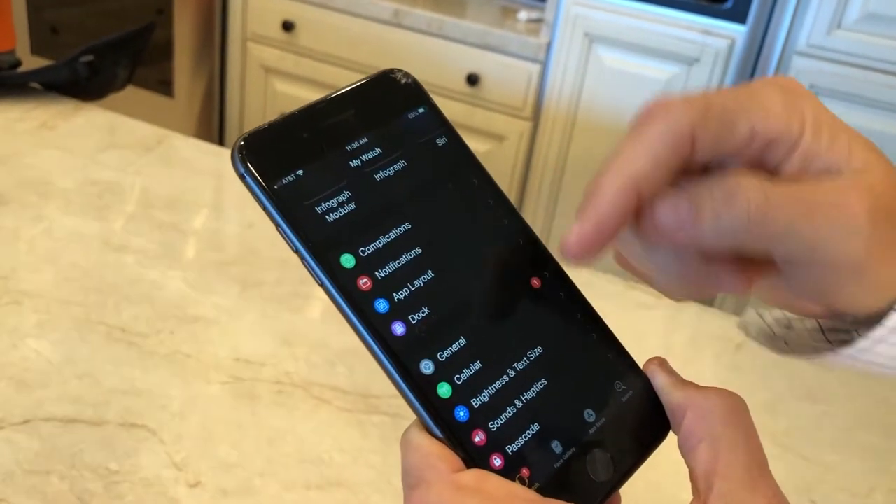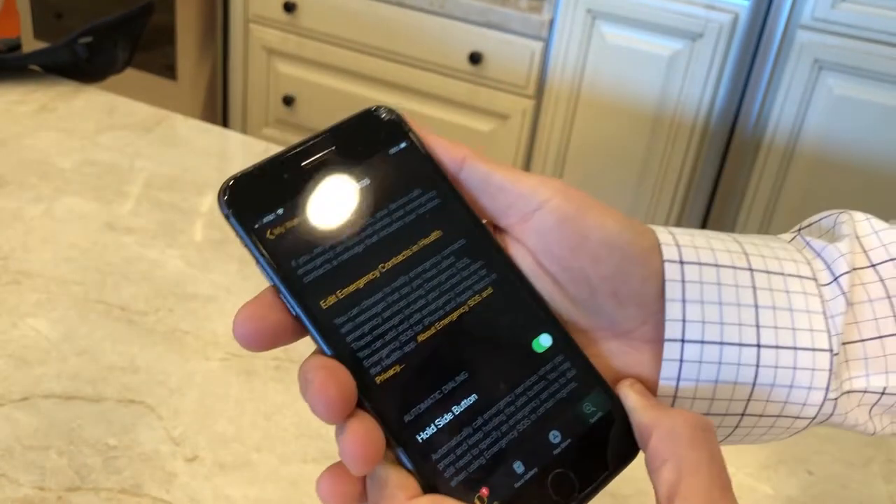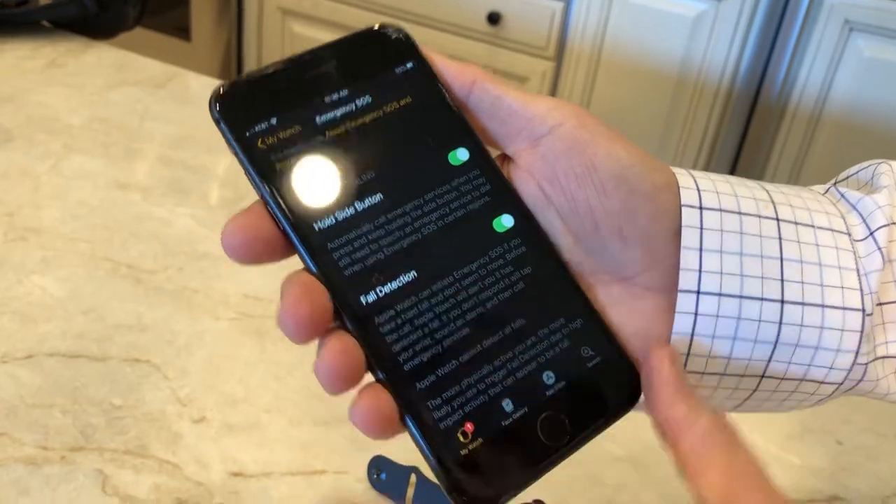Click on your app. Scroll down. Just below General, you'll see Emergency SOS. Click on Emergency SOS, and then slide that to where it shows on for fall detection.